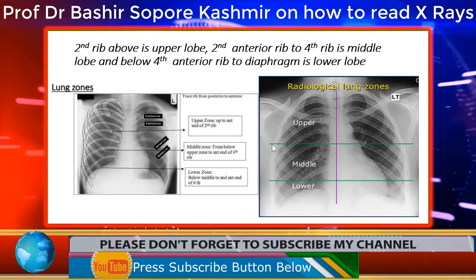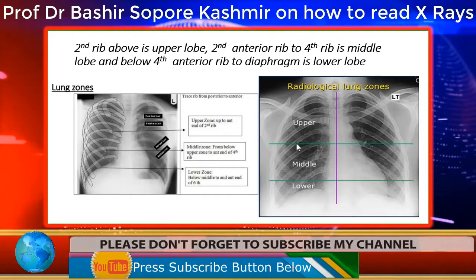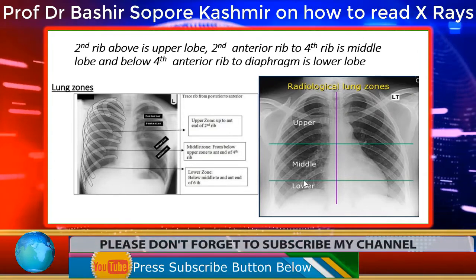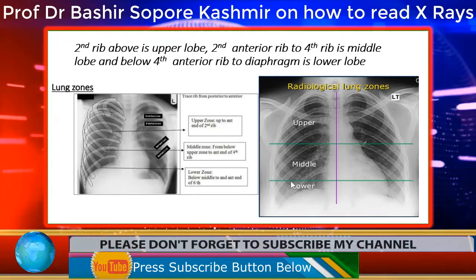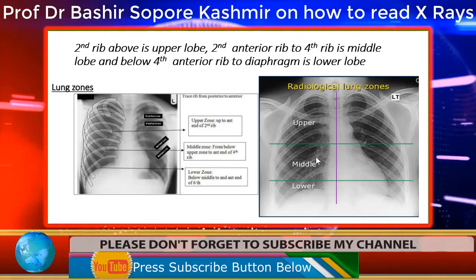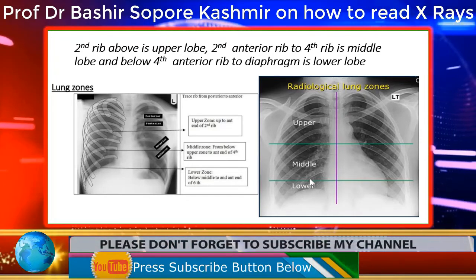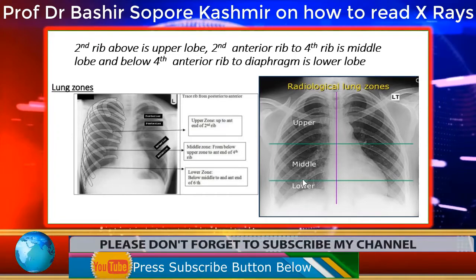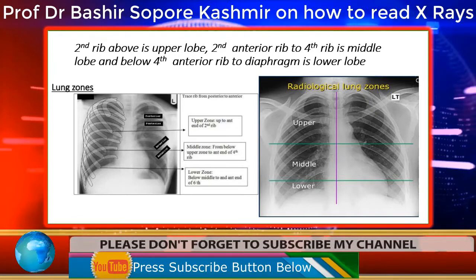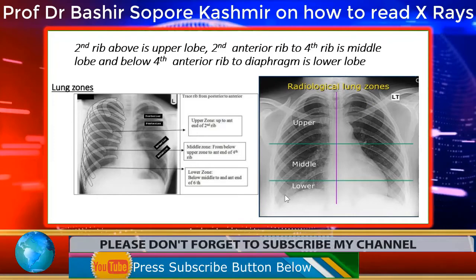So you can see this is the upper zone. This line is at the anterior end of the second rib. Then this is the middle line. This is at the anterior end of the fourth rib. So this will divide it into three parts. This will be the upper zone. Between the second rib and the fourth rib will be the middle zone. And below the anterior end of the fourth rib will be the lower zone. I think this is clear.